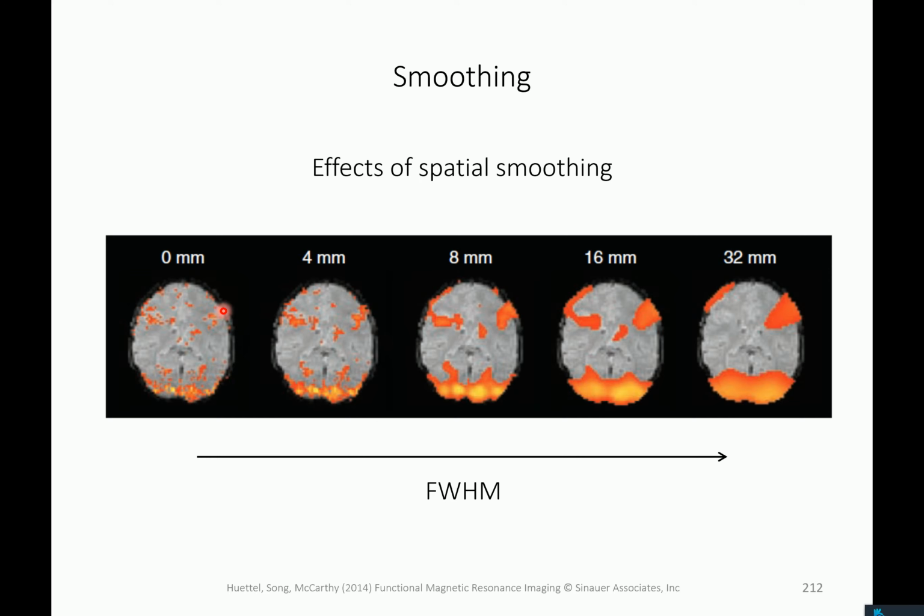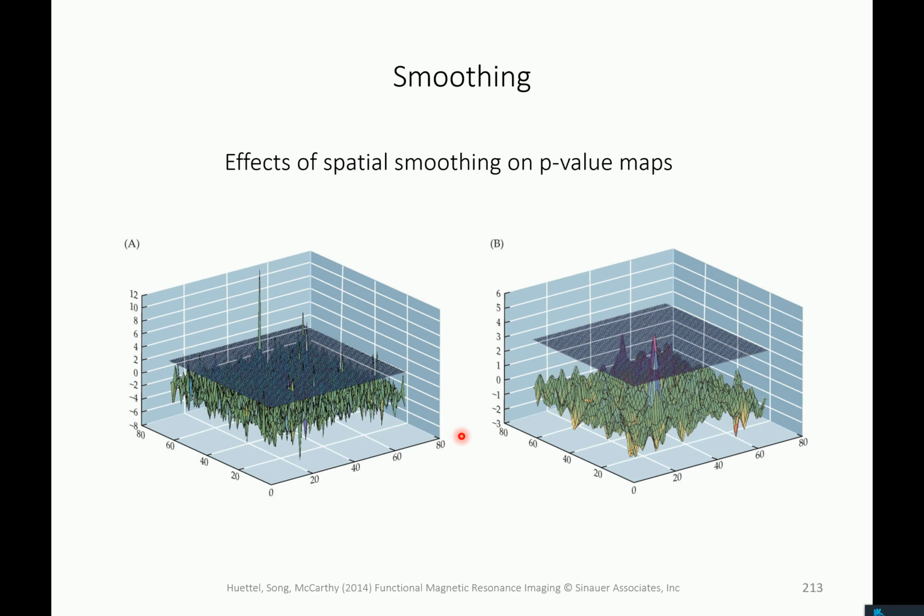You can also say, well, this looks a little bit salt and pepper style. Nobody will believe me that here really something activated. Let's smooth it. Yeah, now it looks nice. And then there's the story about random field theory and smoothing.